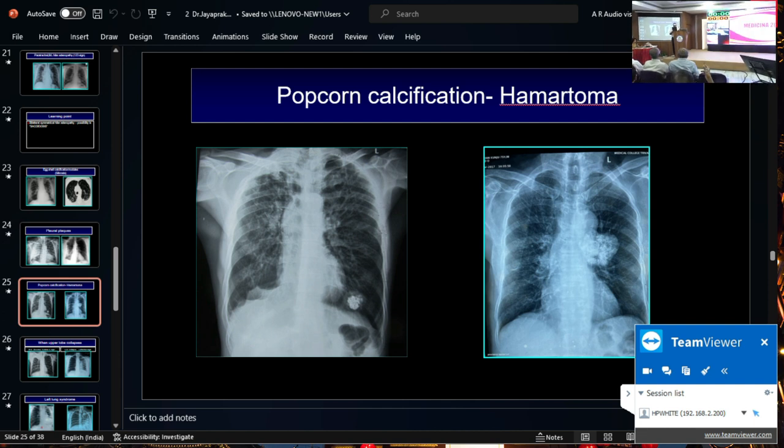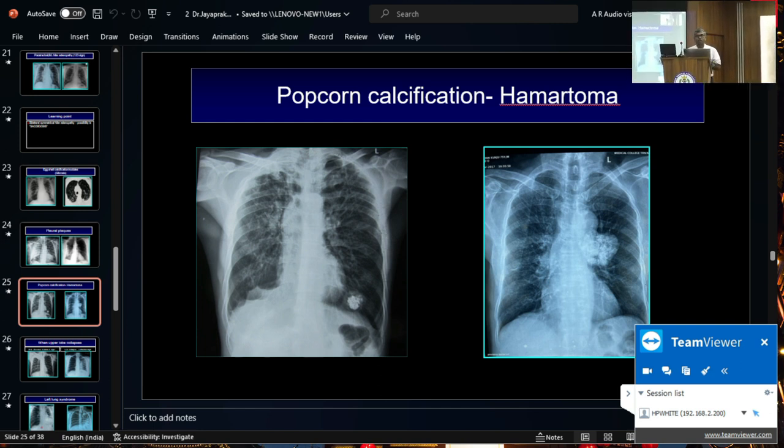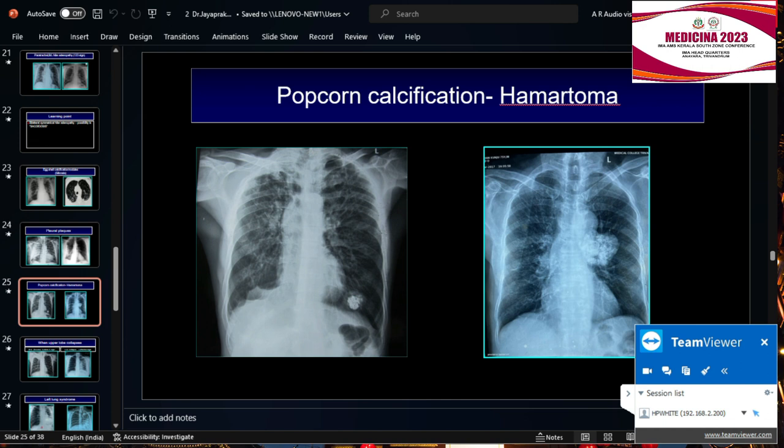Sir, on endoscopy, they looked with the DL scope into the vocal cords. The vocal cords were moving normally. They thought vocal cord palsy was the cause for the hoarseness, but the vocal cords were moving normally. That's why he was referred to us. We did the sputum, just to highlight the importance of an early lesion pickup, or a small lesion in a normal-looking X-ray. That's my point, sir.